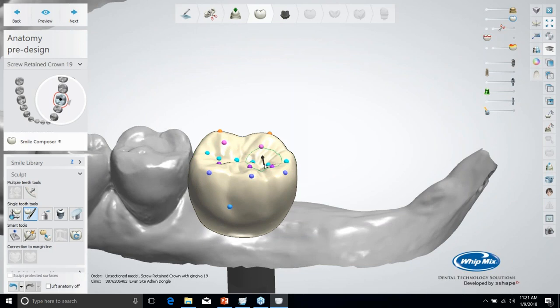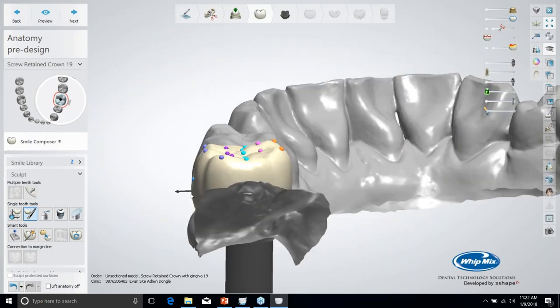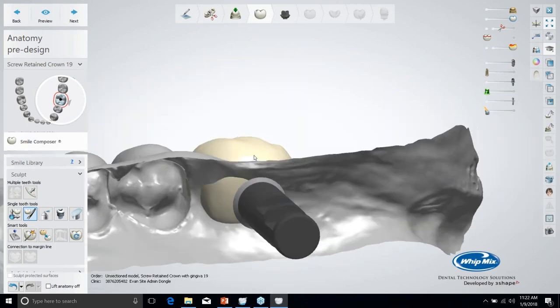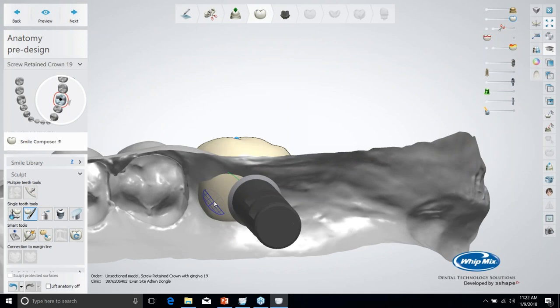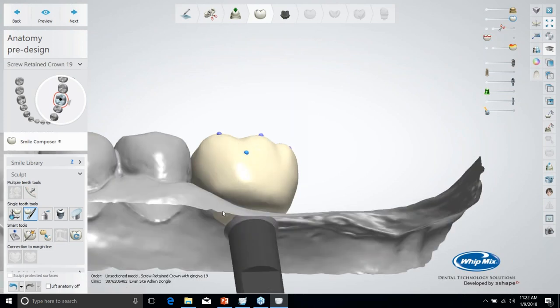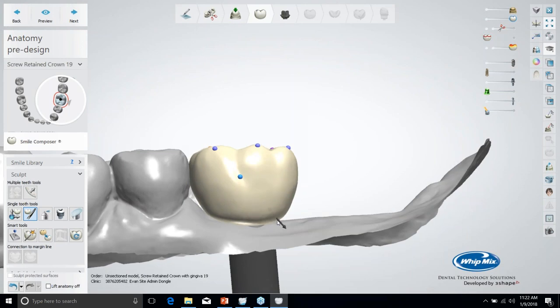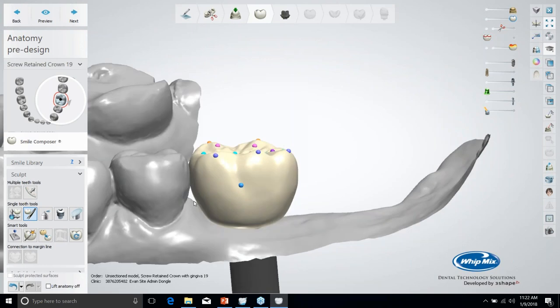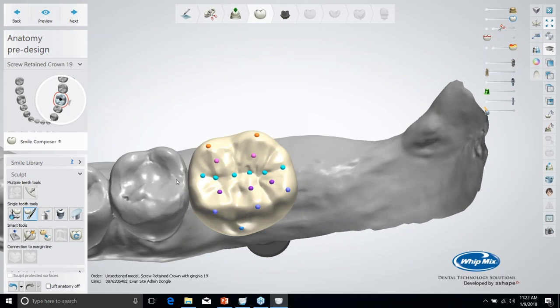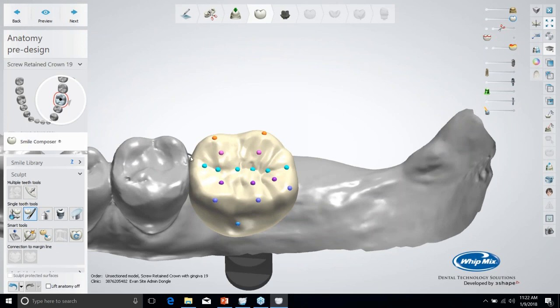So yeah, here you don't have to get all the way to a finished design, because you do have another stage for sculpting this tissue, but generally get it close to what you want. If you're protruding through the tissue a lot, then we're going to want to change that, because that will go through the tissue architecture that we put on here. So even if it looks a little weird with this gap in here, we're going to fill that with the tissue contour. You don't have to worry about cutting your contacts yet. Again, we can do that in the second design stage.